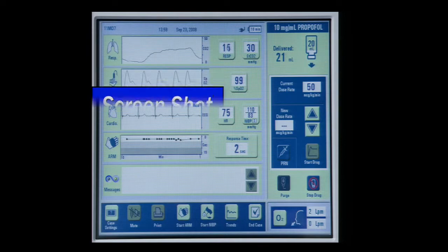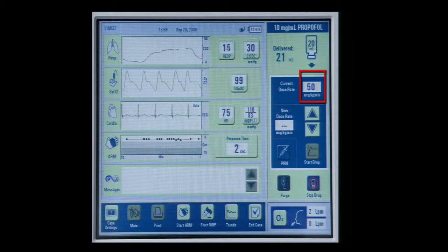This is a look at the screenshot of the graphical user interface, the GUI. This has taken so long to approve, by the way, that this will have to be updated soon because some of these components are now starting to age because the regulatory process took so long. But it's actually a beautiful piece of work, I think. Let me just take you through some of the components.